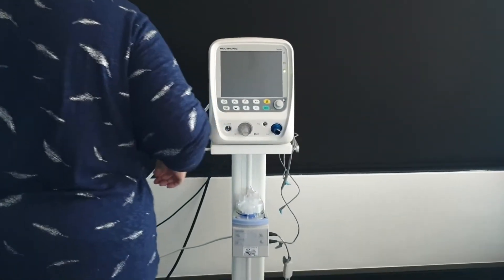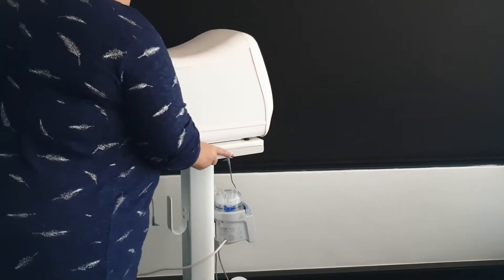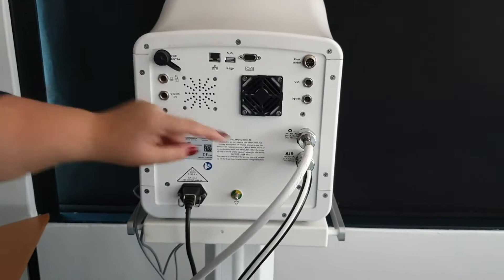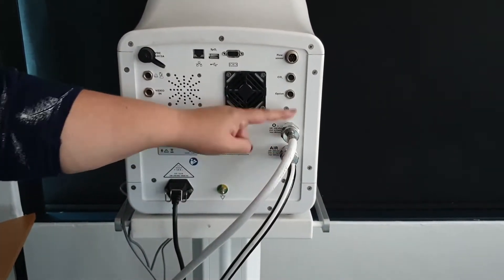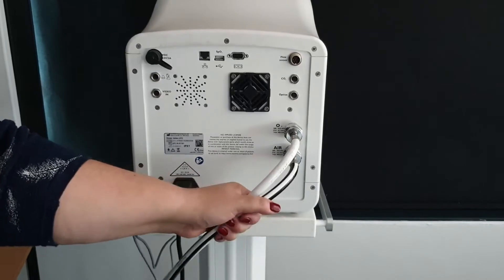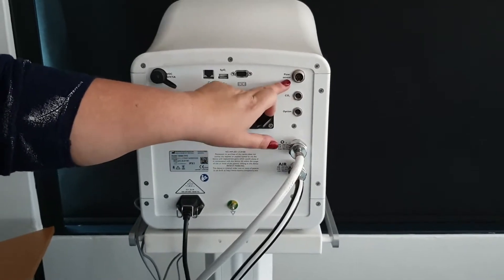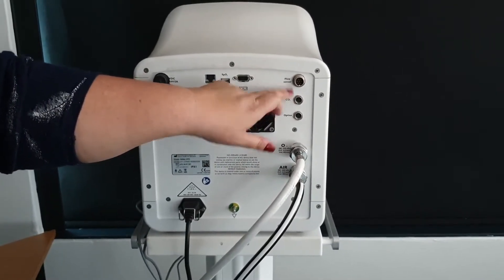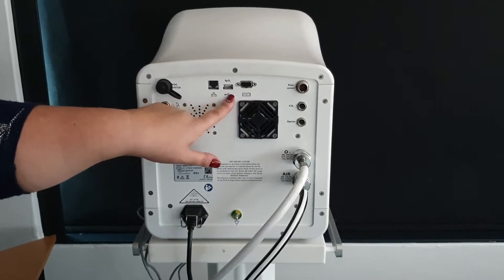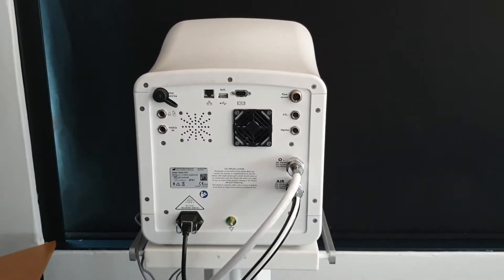Looking at the back of the machine, you will see that there is a medical air inlet — the machine needs medical air and oxygen. For this demonstration I am connected to a compressor rather than oxygen as I am in an auditorium. You will see a CO2 cable, so there is CO2 capability, a flow sensor cable which I will talk about shortly, computer connectivity, and a saturation probe connection.